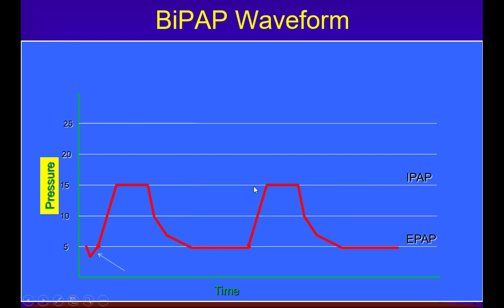This is the IPAP, the higher pressure. Then this is the trigger, and then you have the cycle, which is now marked there, where the IPAP is converting into the EPAP. Then you have this rise time from baseline, when it goes into the achievement of the inspiratory pressure. Then this is the rise time. All right. And then what else do we have?